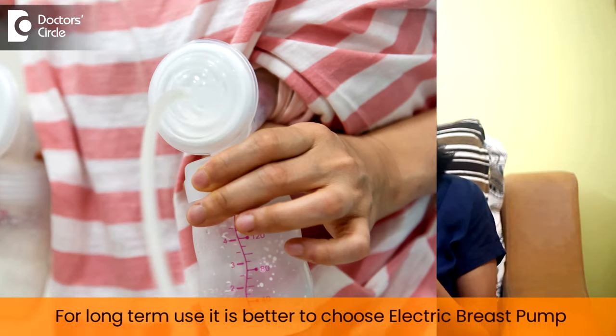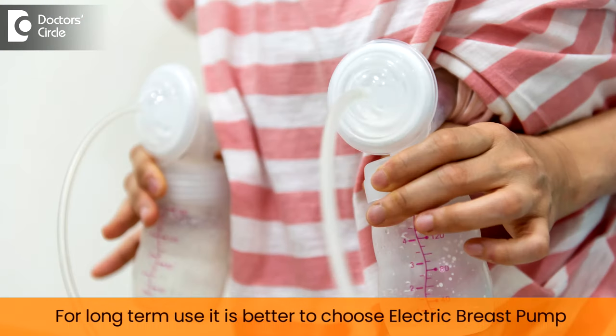When you are looking for a pump, it is very important to select the right pump. All pumps might not be suitable for you. The first question is: why do you need a pump? Are you going to use this pump for long term or short term? If you are using it for short term, you can select any kind of electric or manual breast pump. But when using for long term, it is better to buy an electric breast pump rather than a manual one, because the manual breast pump can be tiring and the electric breast pump is easier to handle.